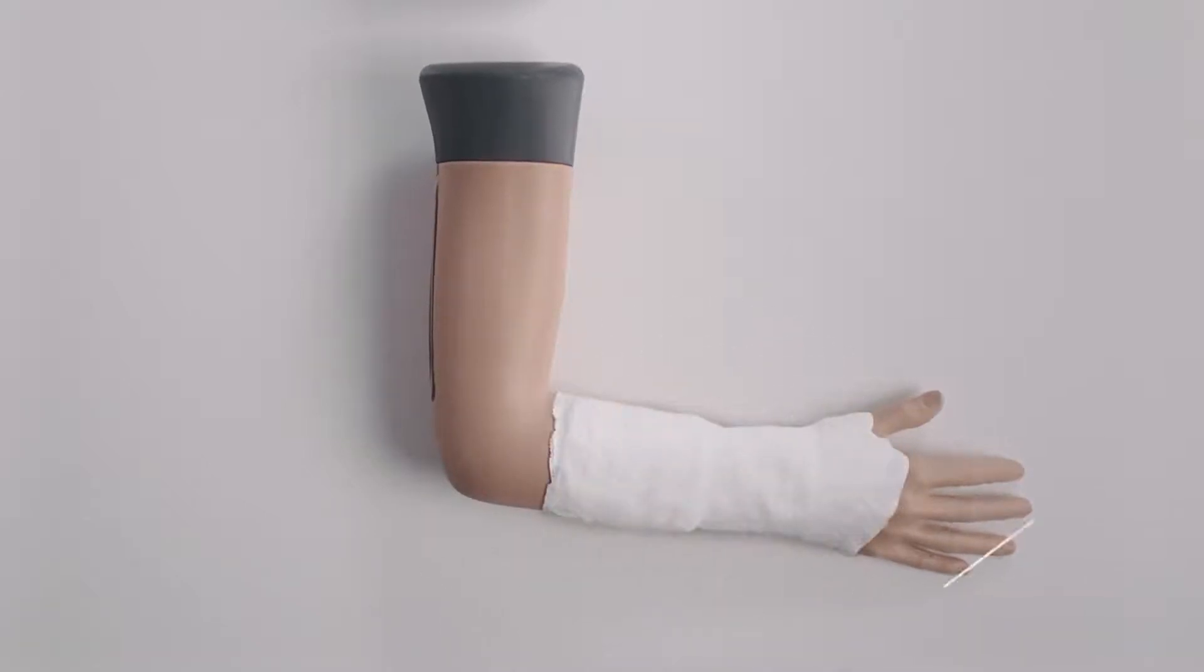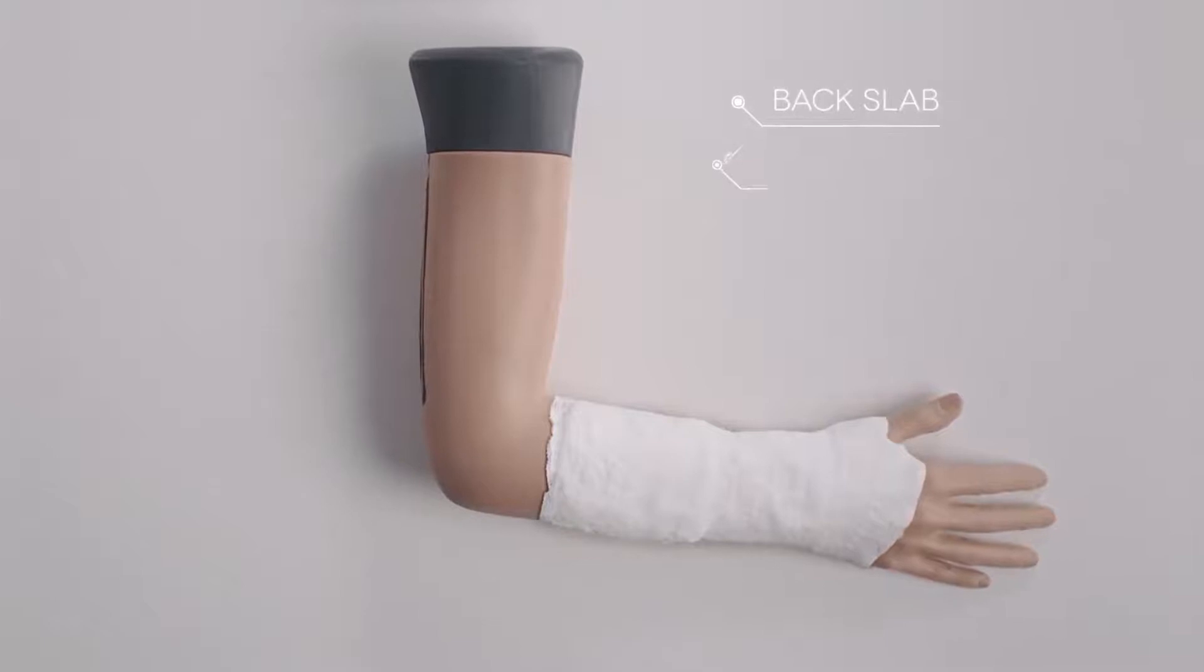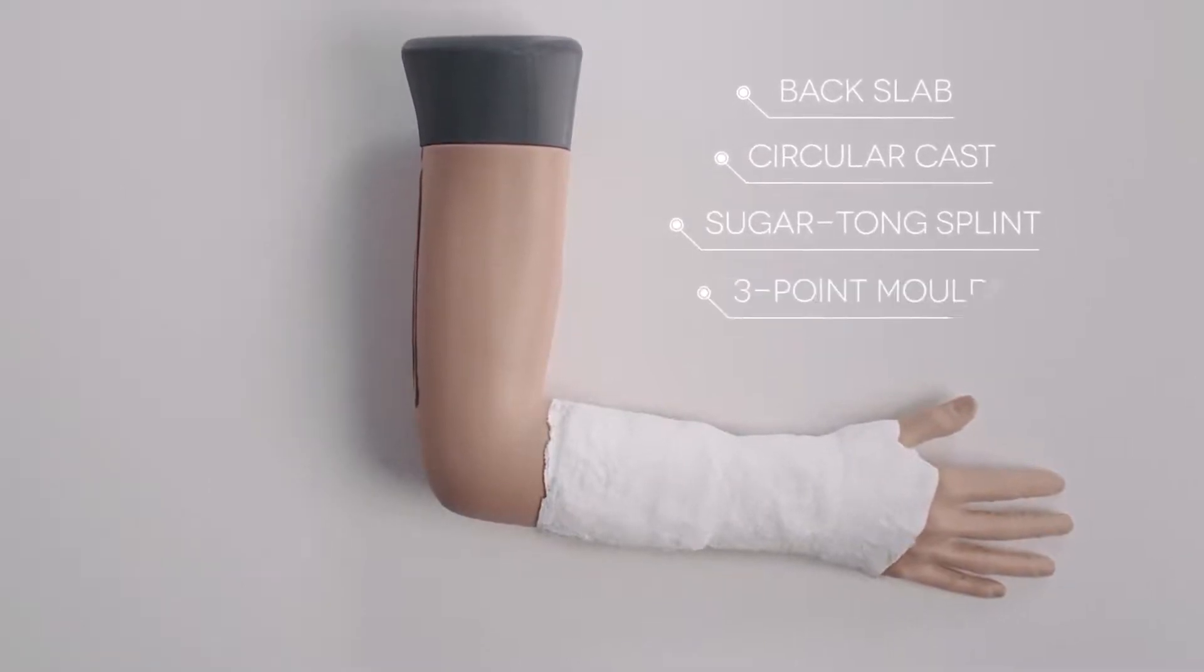The model also accommodates a number of plastering techniques, including back slab, circular cast, sugar-tong splint, and three-point molds.